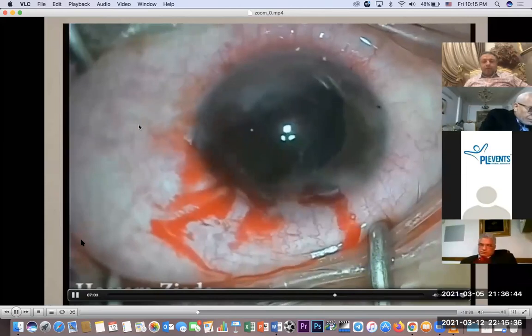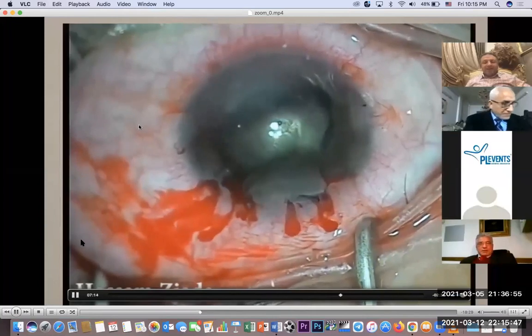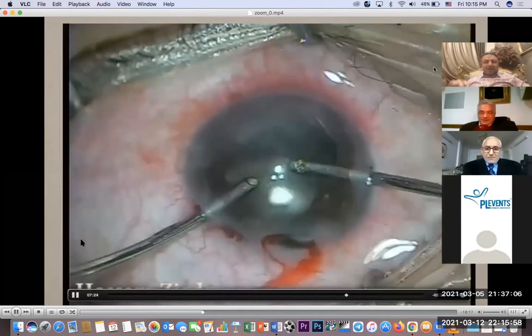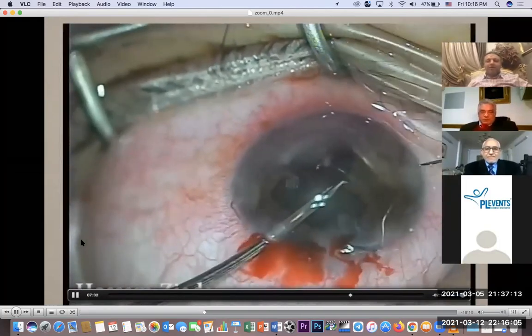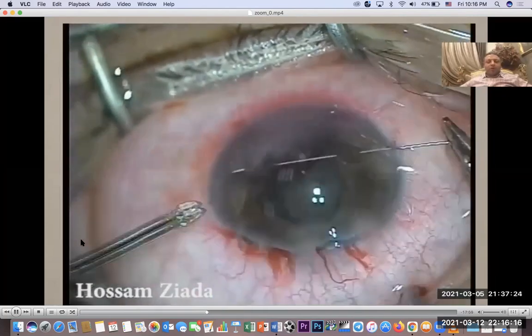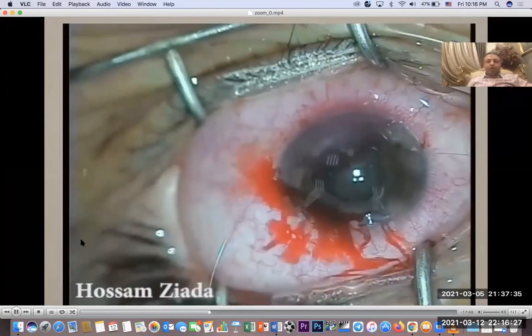So I will try to do a cosmetic step to get a more lovely and more beautiful pupil by iridoplasty using the 4-throw 1-pass stitch. Yeah, I'm going now to put the inferior suture, grasping both sides together, then pass by the straight needle with thin Prolene suture material, from the temporal to the nasal side.